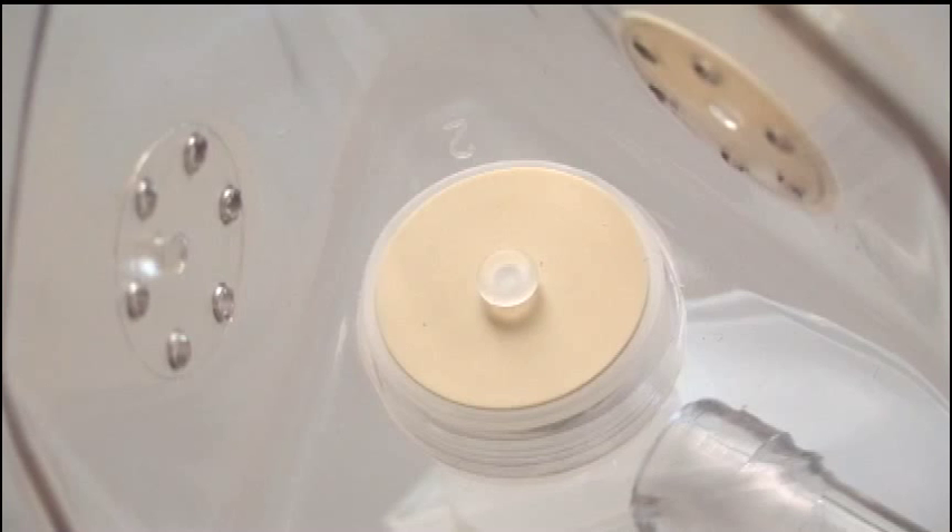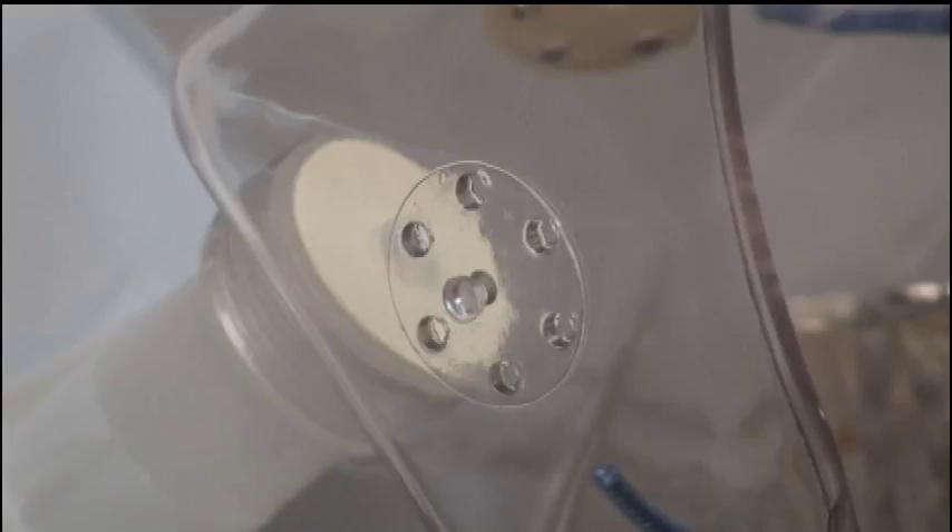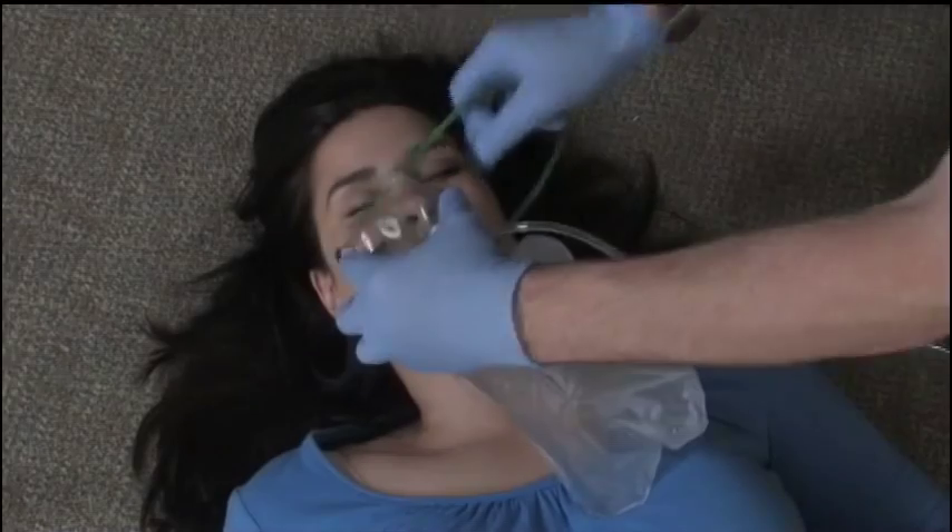The one-way valve prevents the patient's exhaled air from mixing with the oxygen in the reservoir area. The mask also has rubber washers that cover the exhalation ports. These washers allow air to escape on exhalation but keep oxygen continuously inside the mask. Should the oxygen supply fail, the design features an emergency port so that the patient can still take in atmospheric air.